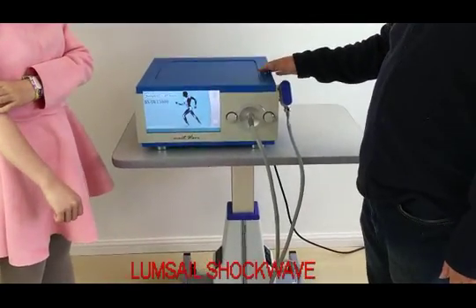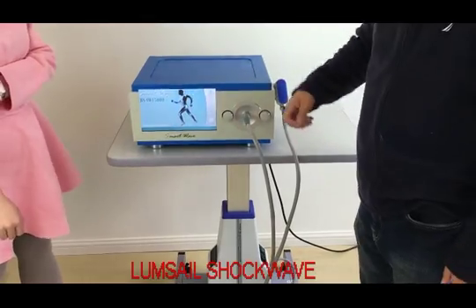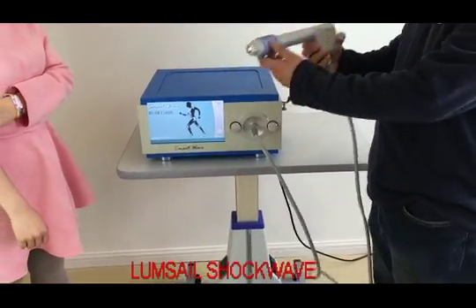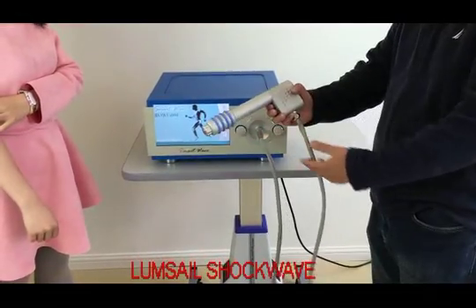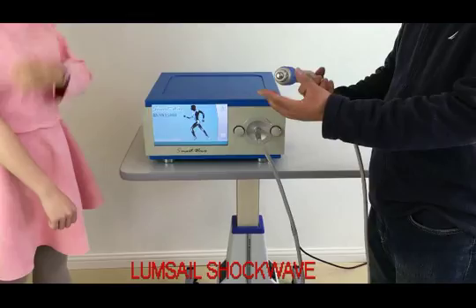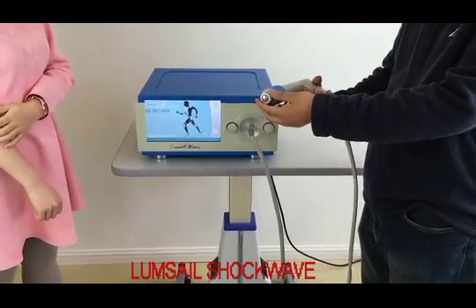This is our latest shockwave therapy system. The model number is B-SWT 5-solid. This is a portable one, but it is much more powerful. Here is a handpiece. We have two kinds of handpiece — it is a portable one and also the latest one. We have five transmitters in different dimensions, targeting two different diseases.